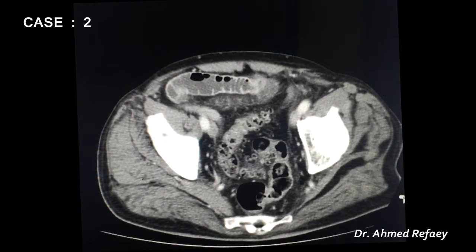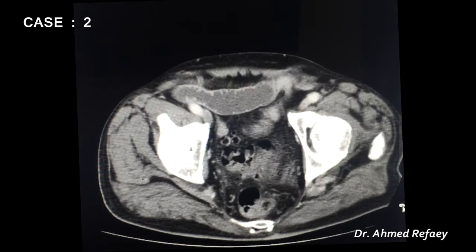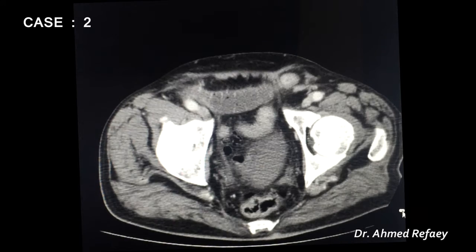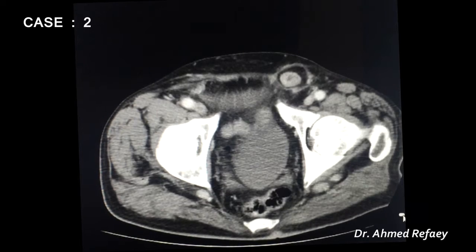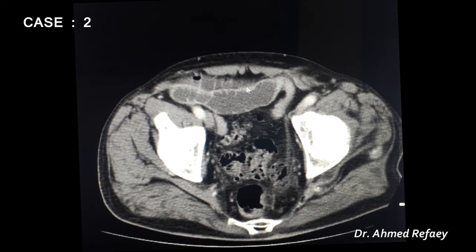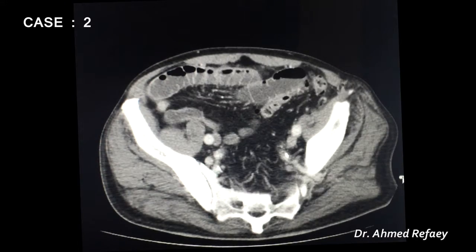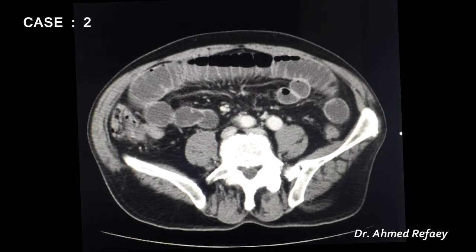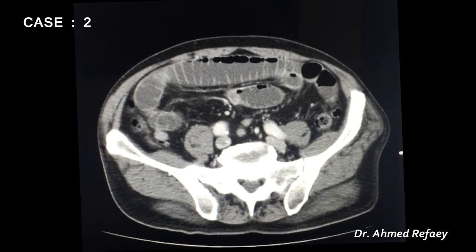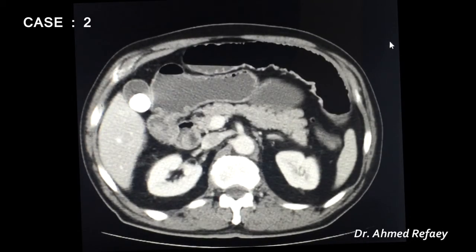Tracing the collapsed loop to the transition zone, we identify an incarcerated left inguinal hernia. The proximal bowel shows marked dilatation and the distal portion has collapsed ileal loops — this is the zone of transition. The diagnosis is small intestinal obstruction due to incarcerated left inguinal hernia. There is no ischemia, as wall thickening and enhancement are normal, and no intraperitoneal free air to suggest perforation. Incidentally, there is a large gallbladder stone with no cholecystitis.